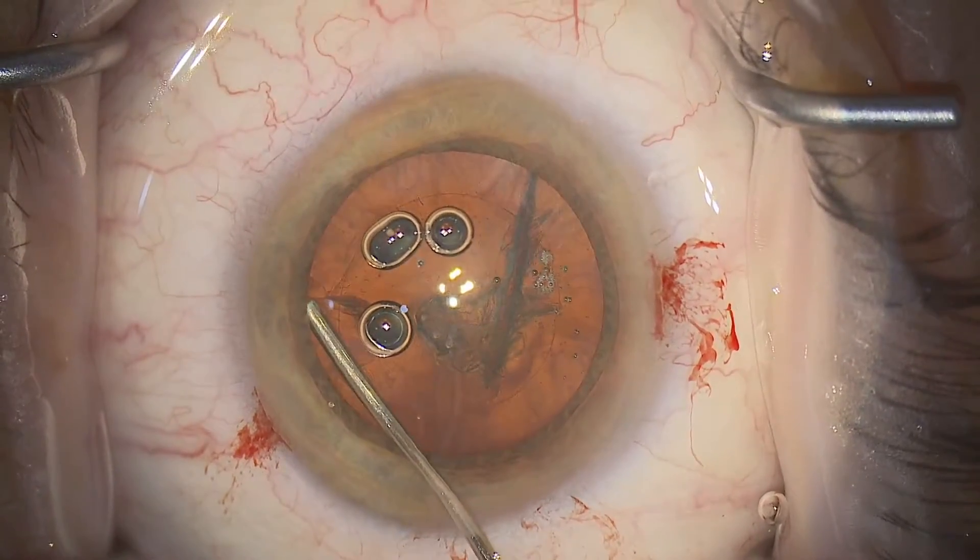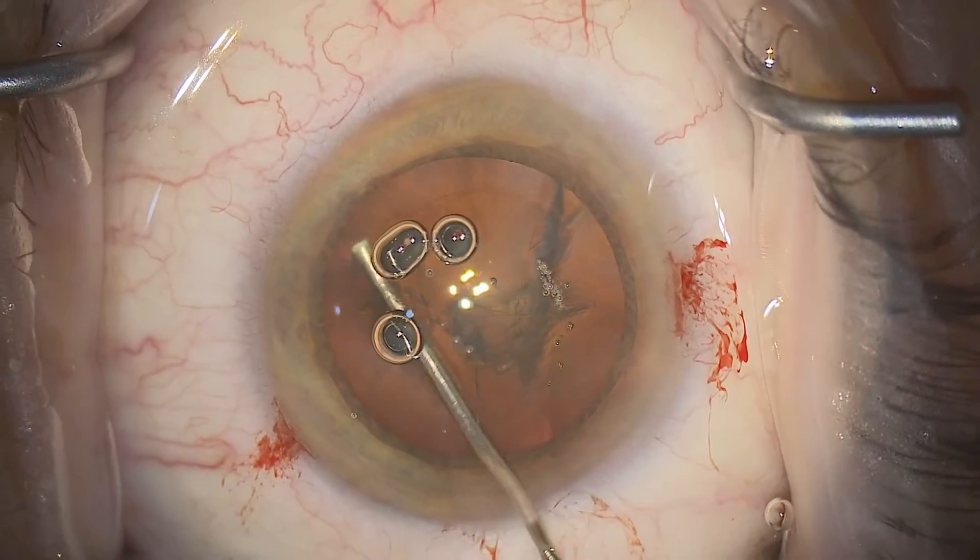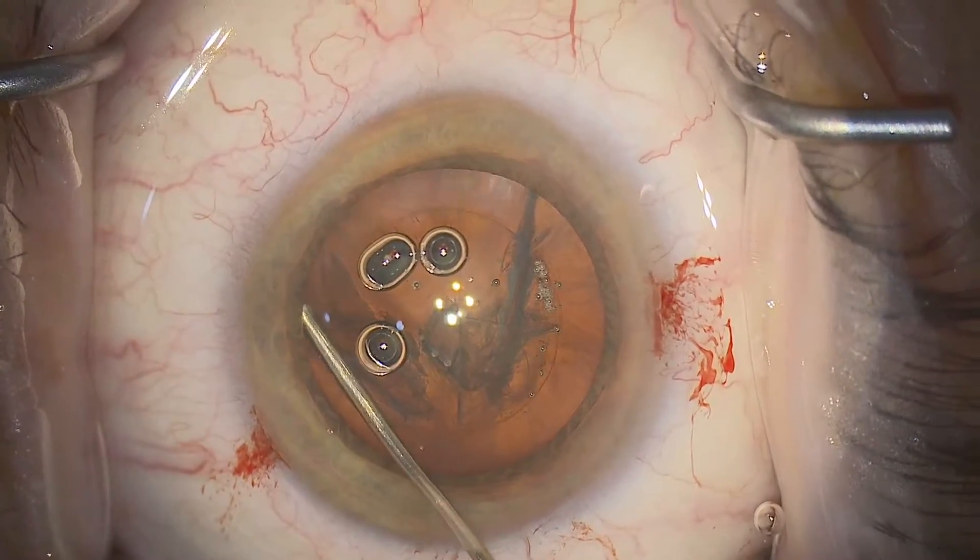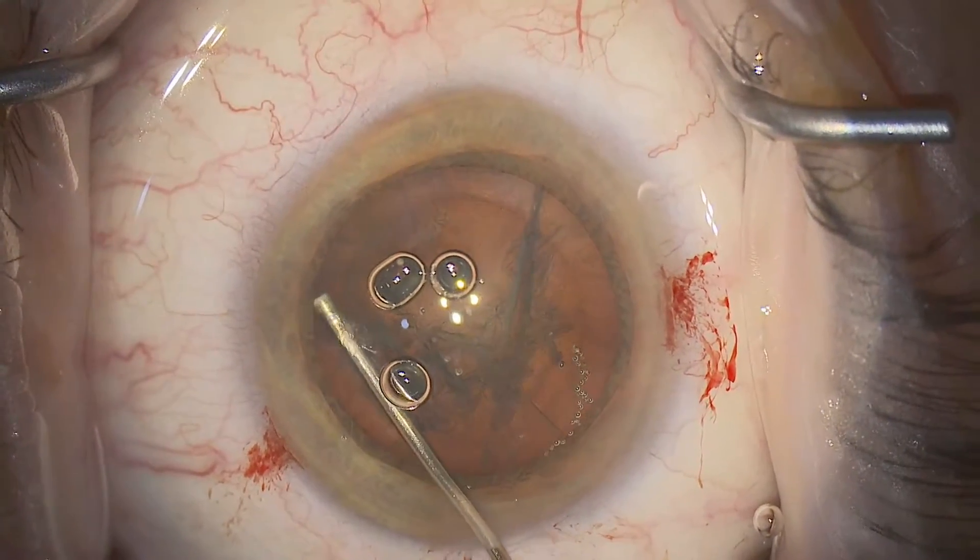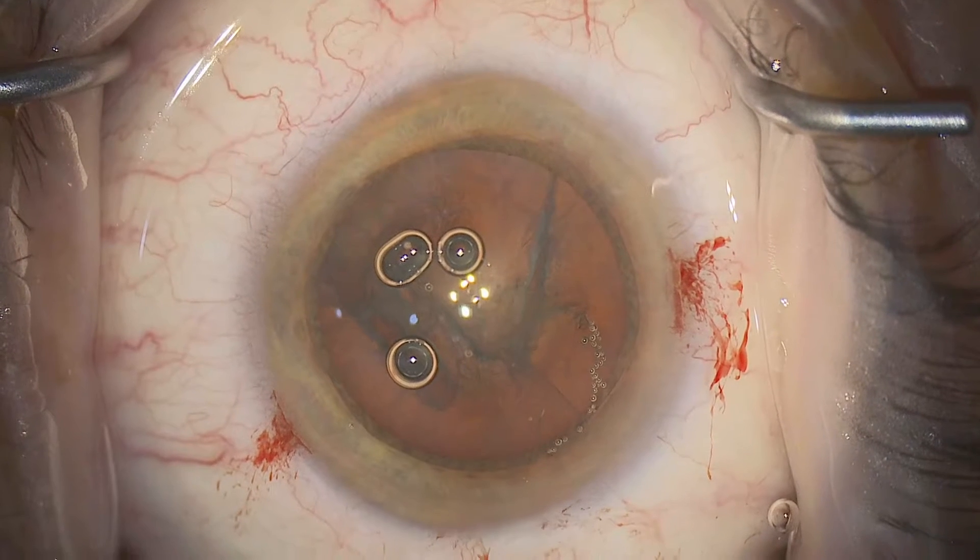The more work you do with the hydrodissection, the less work you have to do rotating the nucleus subsequently. So it's nice to go to the other side and repeat stages three and four, blotting the nucleus to make sure that it's free.